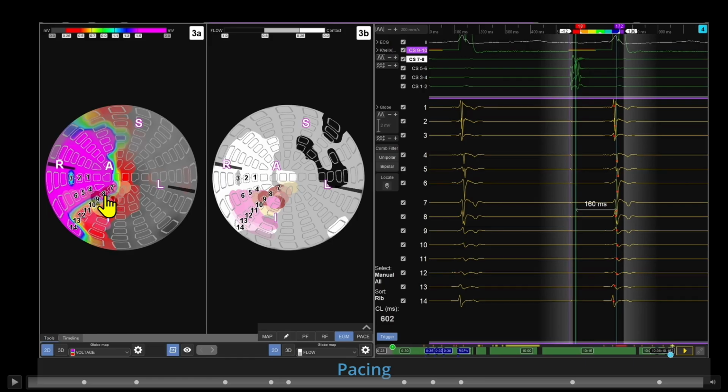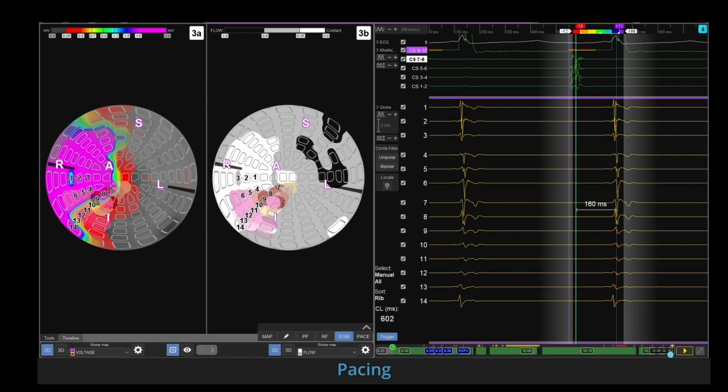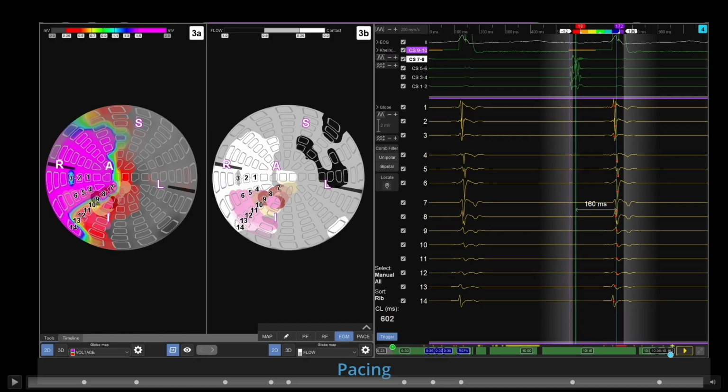So you could, for example, in some instances, put the array just on the line, pace from one side, and look at activation on the other side. You can't always do that because you've got to have enough electrodes with potentials to be able to do that, but sometimes you can.